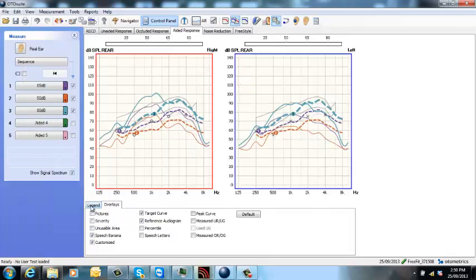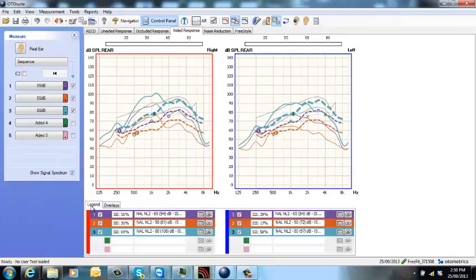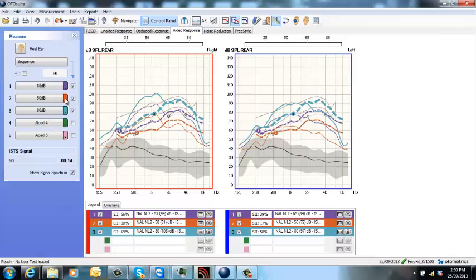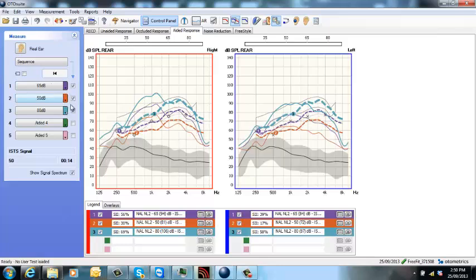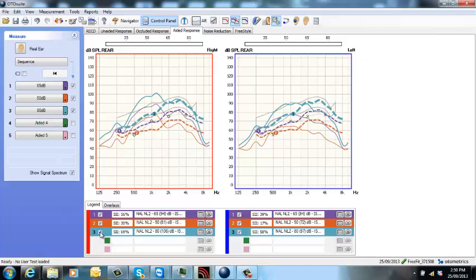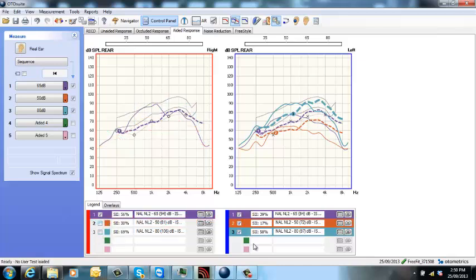If this is still too busy and you just want to show the 65 dB, remember that the colors are represented here. So purple is 65, red is 50, and blue is 80. So I can just untick the ones here that I don't want and I just want to print out my 65.